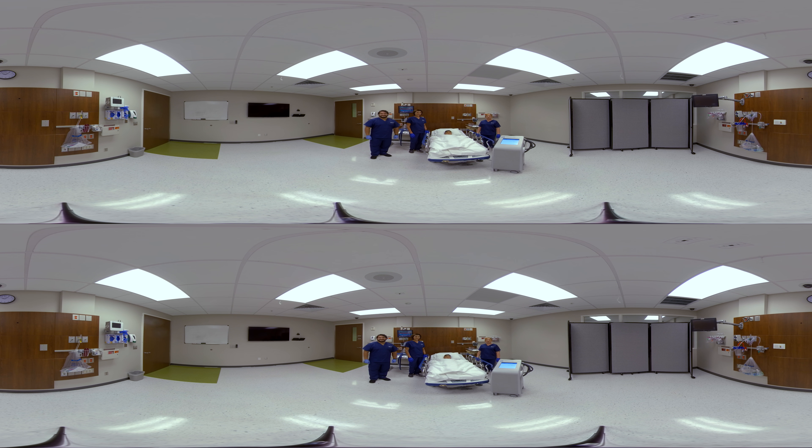Next, we will demonstrate how to use a package of four Arctic Sun gel pads. For Cruz, we're going to select extra extra small pads, which come in a package that looks like this and has a label at the bottom. You can ensure that they are not expired by checking the date. When we open that package of four pads, we'll have two torso and two thigh pads.